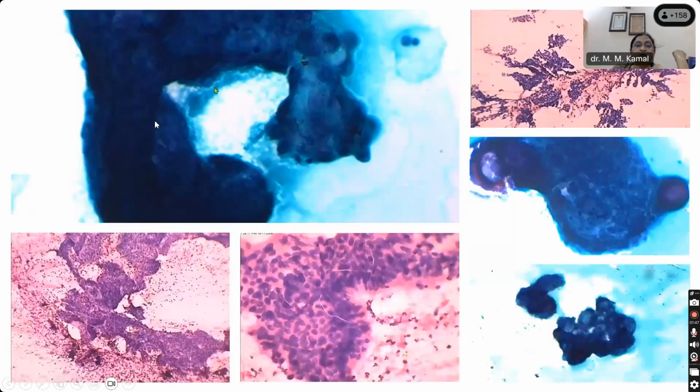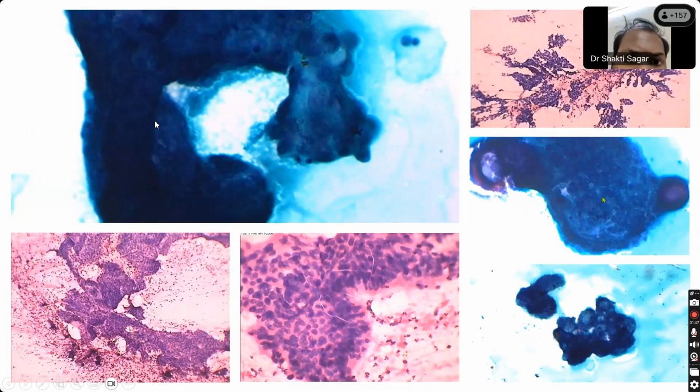So now, just extending a little bit, which is this? Again, if she's a female with an ovarian tumor, it is a very obvious diagnosis. Mucinous adenocarcinoma? Serous adenocarcinoma. What is this arrangement called? Papillary arrangement. You can see fibrovascular cores and cells coming out of that.